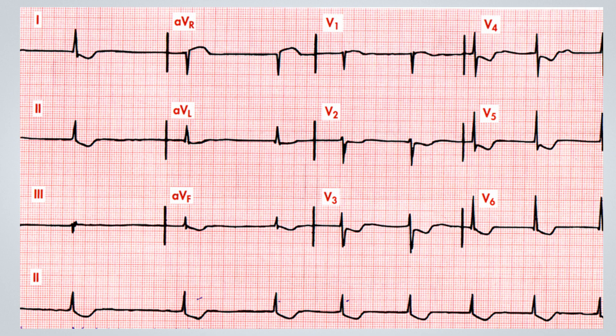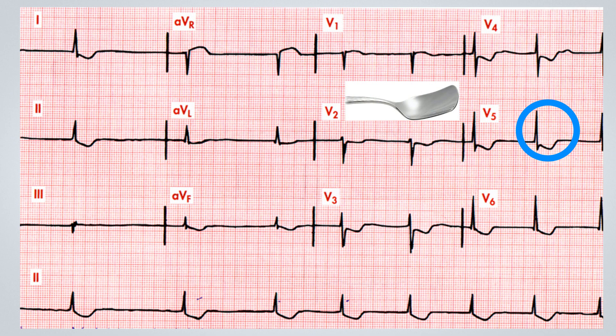However, instead of a high ventricular response, it is exhibiting a low ventricular response. The patient is also experiencing nausea. Upon scrutinizing the ventricular repolarization, we detect an alteration in the ST segment. This anomaly is visible across all leads, particularly leads D2 or V3 to V6. This pattern is akin to what we term the spoon sign, which is not indicative of digitalis toxicity, but of digitalis saturation.